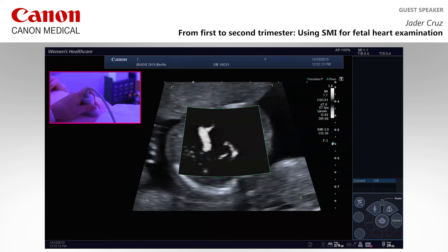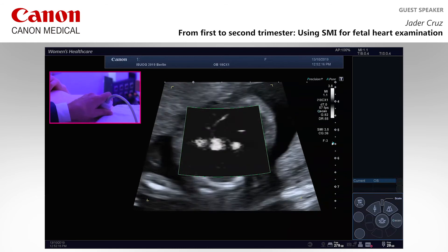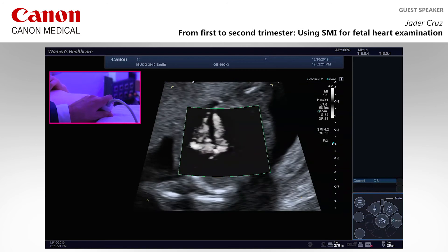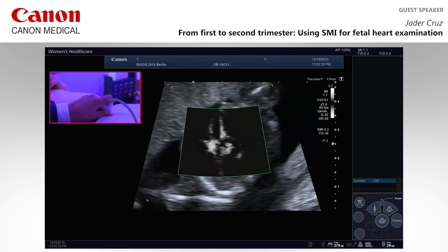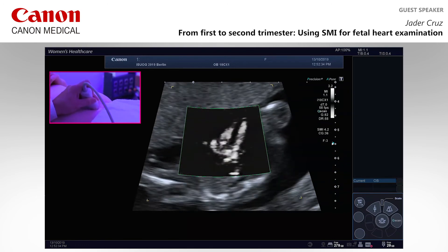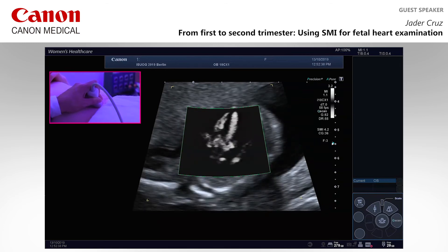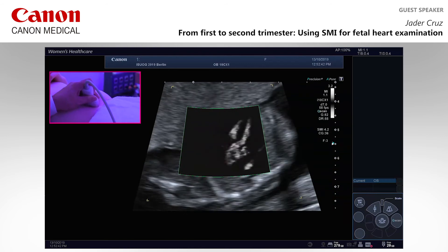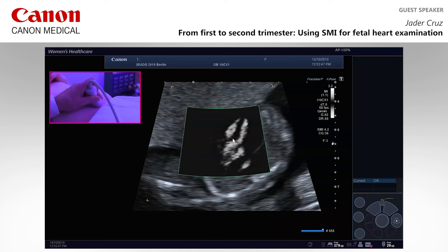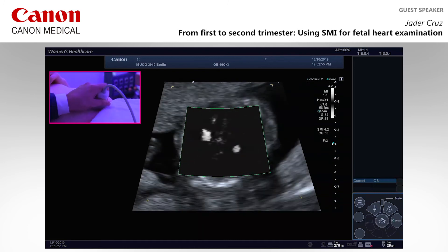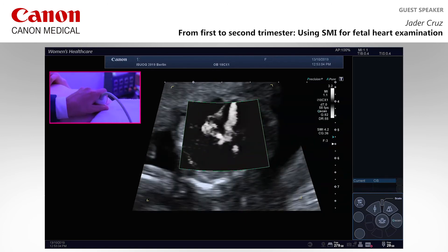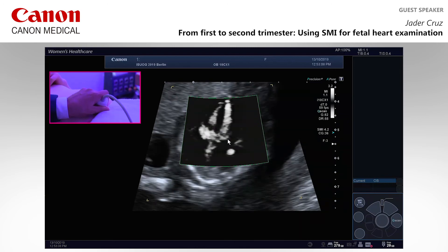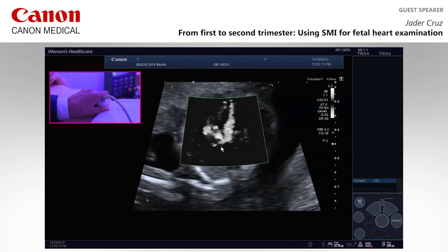You can see the perimembranous region. We are not at a right angle to the septum and you can still see it very well — you don't really need to be at the right angle to see it. With a normal sweep moving to the outflow tracts, you can clearly see there is no communication in the perimembranous part of the ventricle. The pulmonary artery view doesn't really benefit much from SMI here.